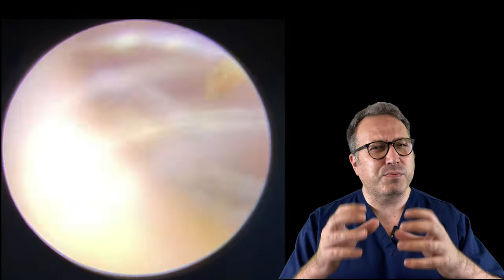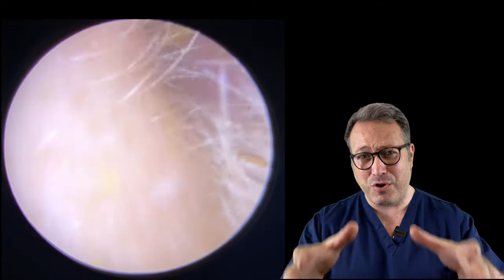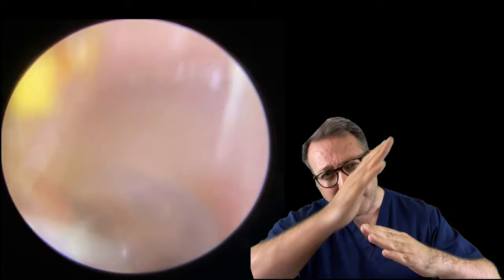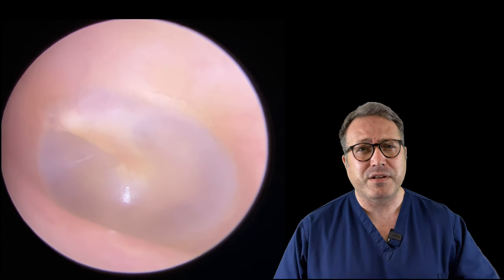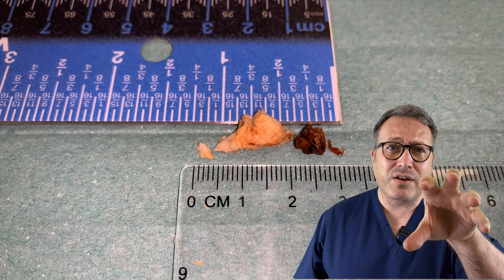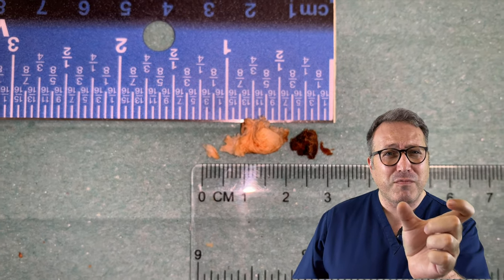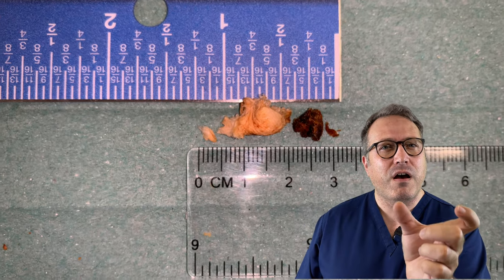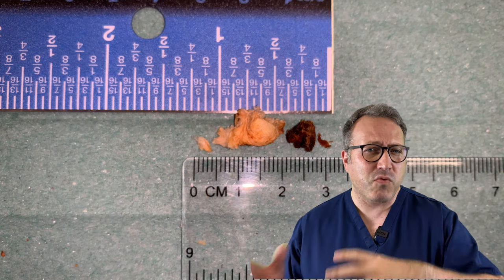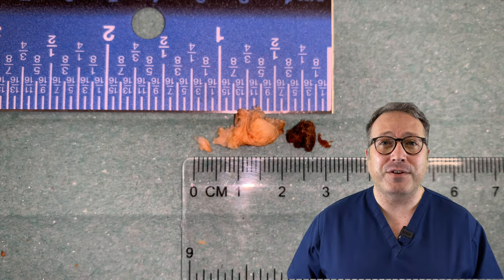Perfect. Quite a large block of wax, but just look at that eardrum - that is a picture-perfect eardrum. So shiny, so pearlescent, lovely light reflex in the bottom left hand corner, hammer bone really clearly visible coming down from top left to the middle. This is what we removed - you can see the tissue paper, about three quarters of an inch of it, and then the piece of wax to the right hand side is what we removed from the second ear.